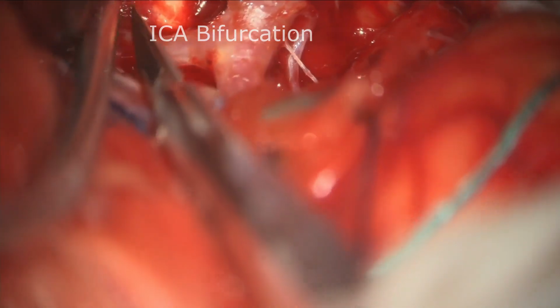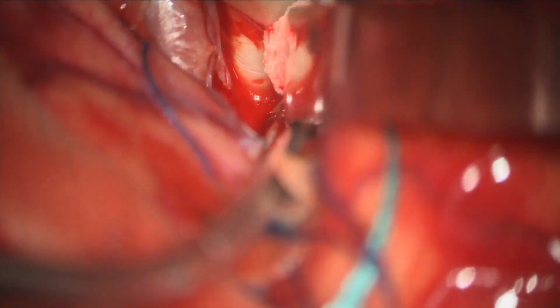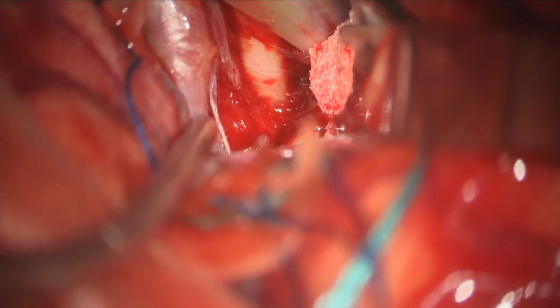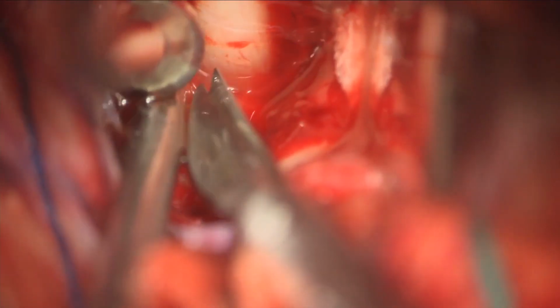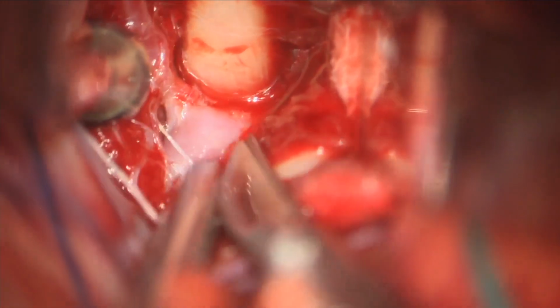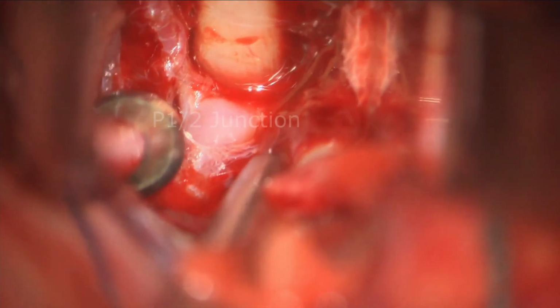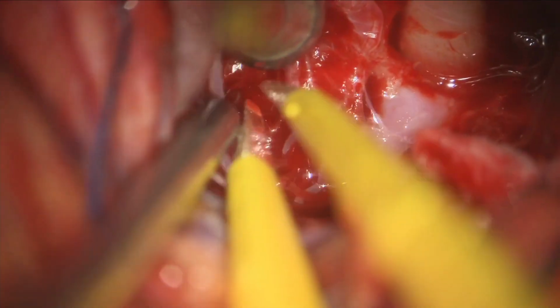With dissection of the Sylvian fissure, we can also view the carotid bifurcation, and the retractor can be repositioned as needed to widen this working area. The next step, we identified the posterior communicating artery and followed this to the P1, and here we see the P1-2 junction. And following this, we started to work medially towards the basilar apex.